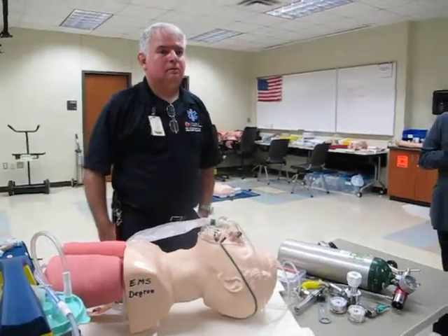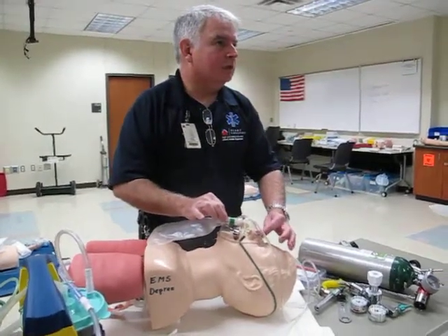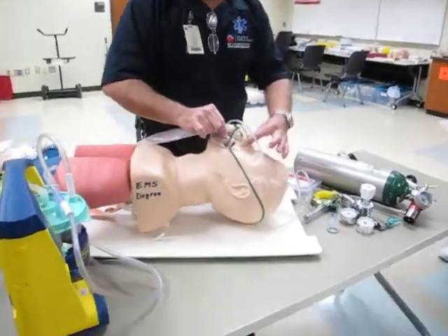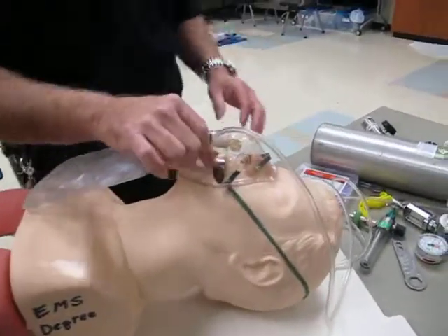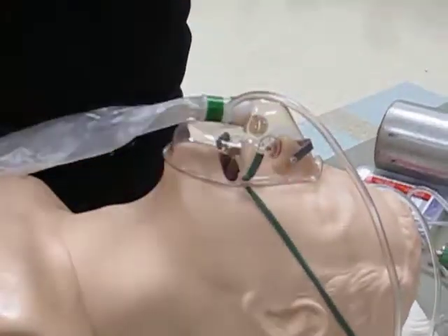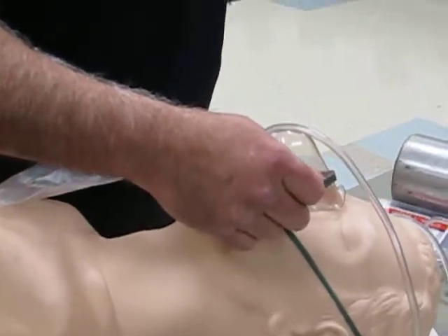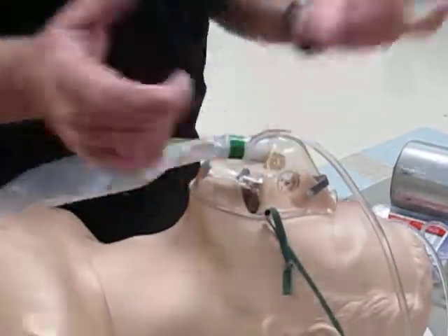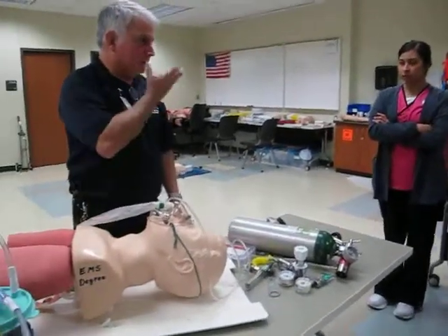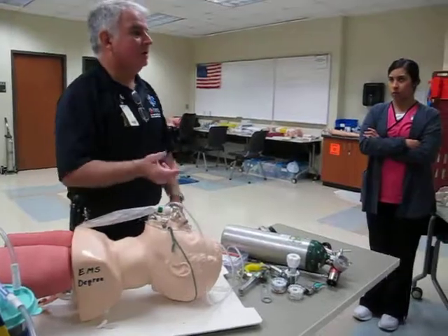If you can't get a clear seal, adjust the mask. It has a little aluminum nose piece — everybody's face is shaped a little different, so situate it as best you can. Pinch the aluminum part around the nose to help hold it up tight. Tighten the little straps as needed to achieve a good seal. You don't want it over tight — no indentations — but snug it up good so the patient is getting the maximum oxygen possible. When you take it off, never have a dead device: take it off, then turn it off.